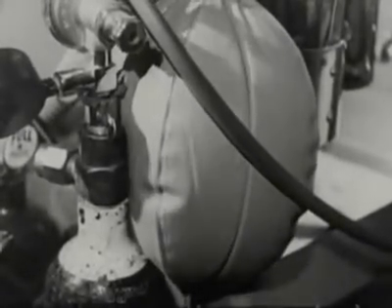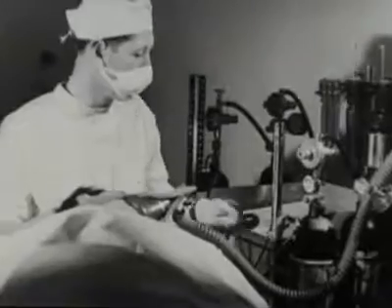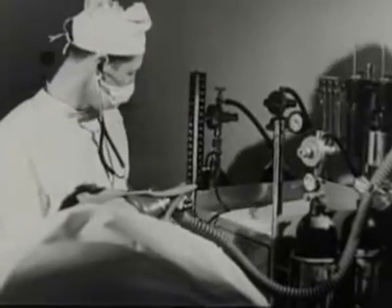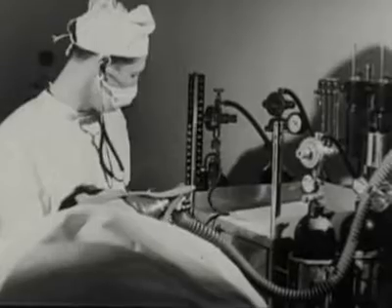Provided the cylinders don't run short, the maintenance of anesthesia is more or less automatic, and you're free to concentrate on the patient's condition and to take blood pressure and pulse readings, a great advantage when he's seriously ill.